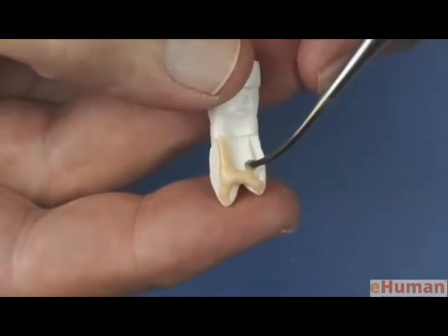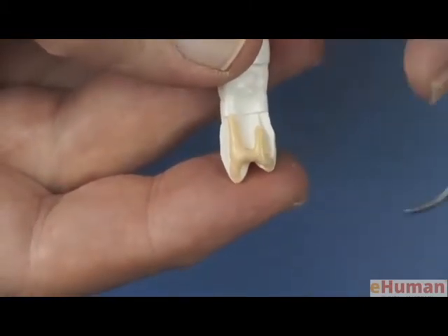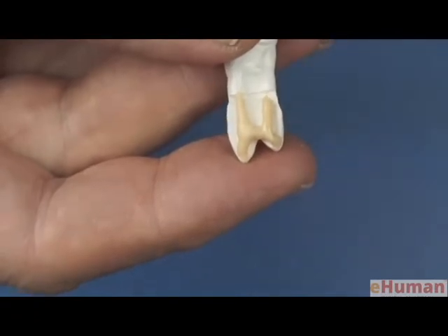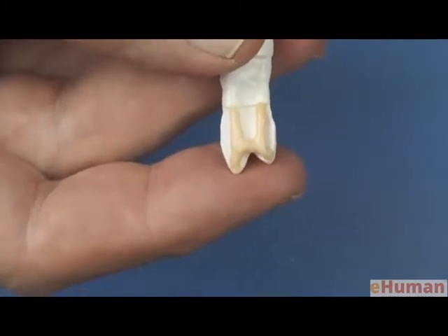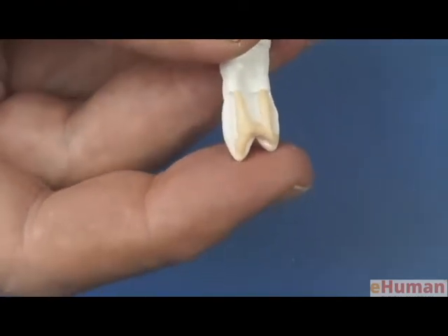And let's do the lingual one. Once we've completed those, then the next step is to fill in the facial and lingual contours.